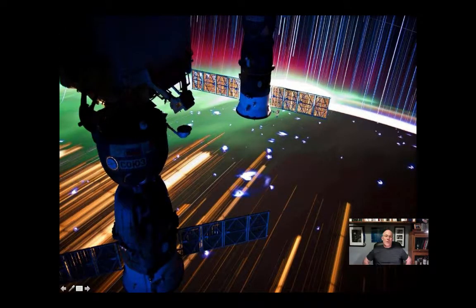Space is actually a really unique environment because you're going 17,500 miles an hour around the Earth in low Earth orbit, which is about 220 nautical miles above the surface. You're circling the Earth every 90 minutes. Your communication with the ground can sometimes be limited, so having something that you can train a crew to use with relatively minimal training and be able to get diagnostic quality images was a really strong requirement for us, and ultrasound met that demand.